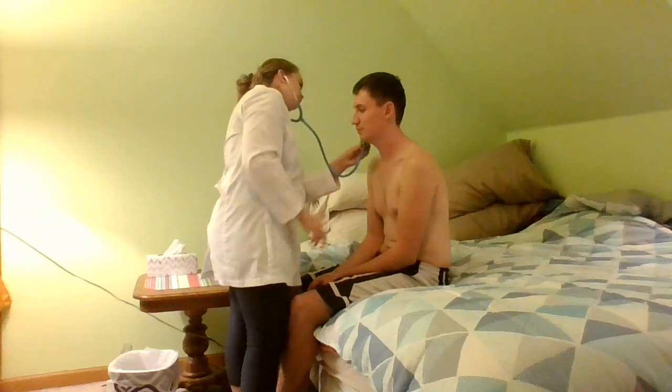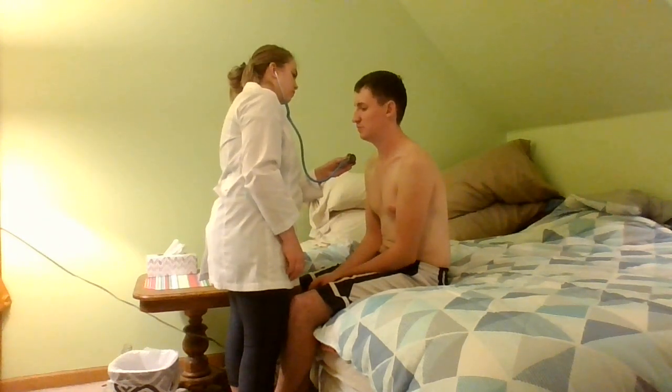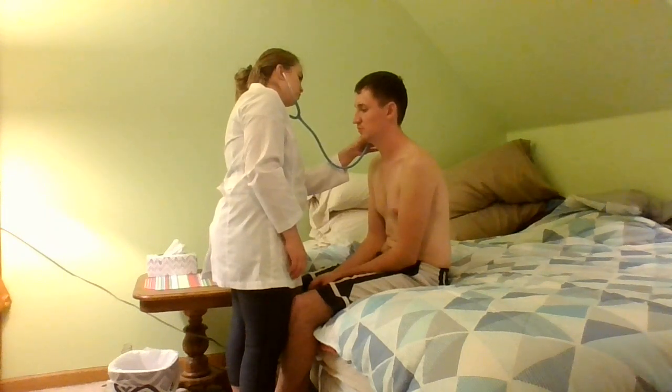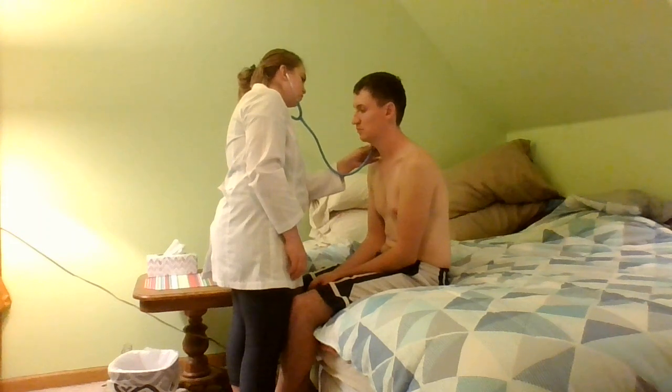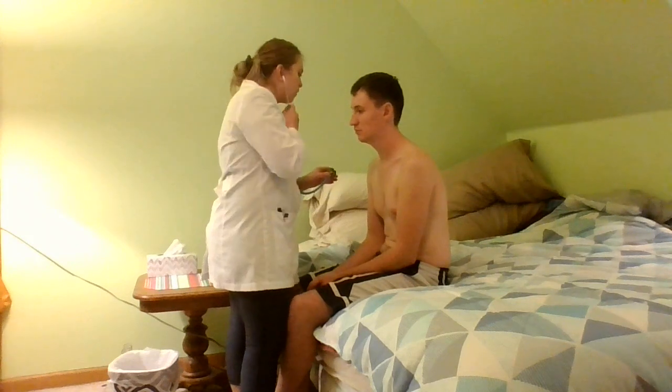I might do so on the other side as well. Take a breath if you need it. Okay, I didn't hear any whooshing sounds or any signs of bruit, so that's a good finding.